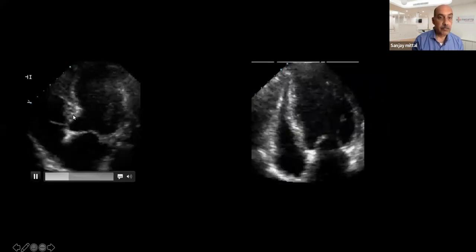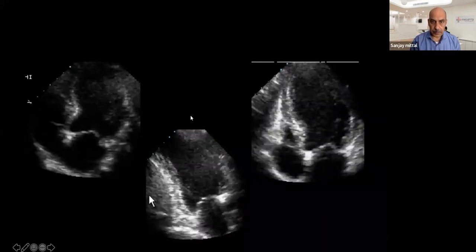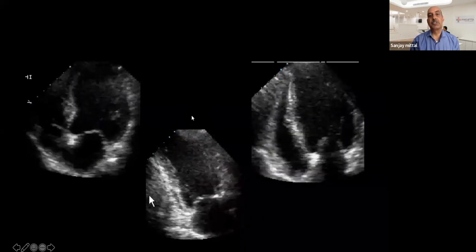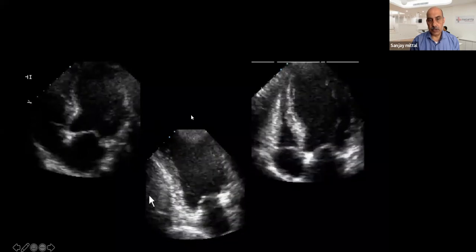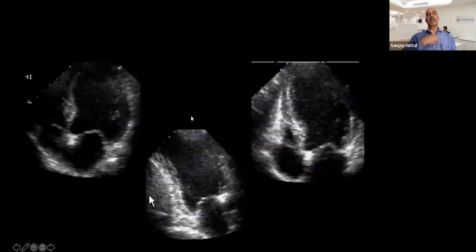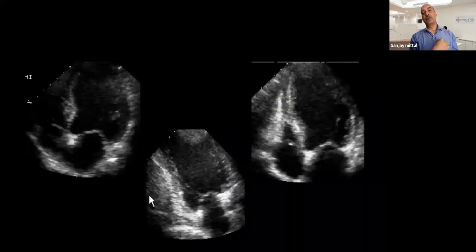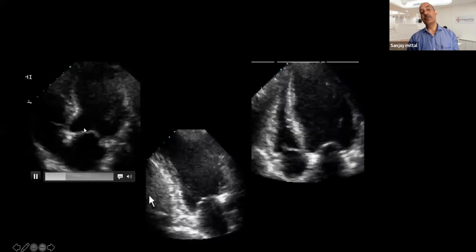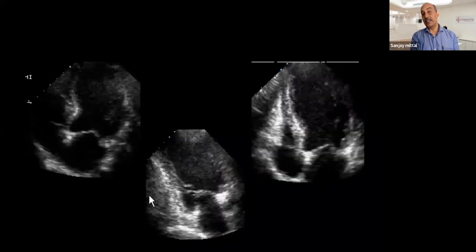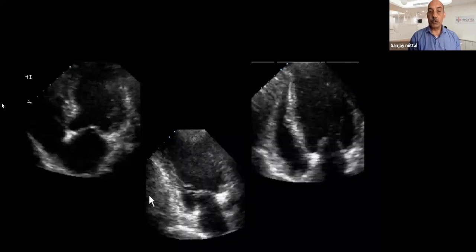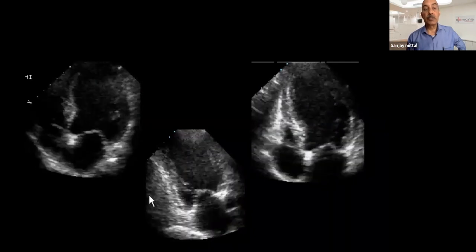Regarding assessment of global left ventricular systolic functions: we have moved away from M-mode, as M-mode cuts the ventricle in one direction and can give erroneous assessment. The biplane Simpson's method — modified Simpson's method — on 2D echocardiogram using four-chamber and two-chamber views is the best. The long axis of the ventricle is cut into 20 disc segments; the volume of each disc is calculated and summed. Both diastolic and systolic volumes are calculated to give ejection fraction.